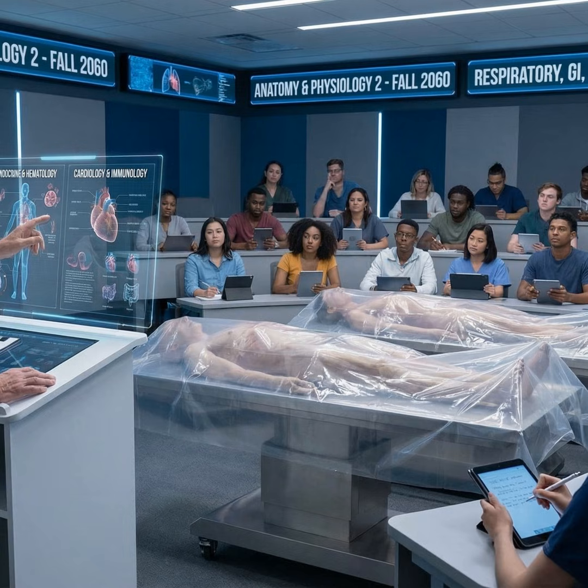Step 1, the very first number you should look for on any PFT report is the FEV1 to FVC ratio. Seriously, this is your starting point. It's the anchor for the entire diagnosis. This ratio is your first major clue. FEV1 is the volume you can force out in 1 second, and FVC is the total volume you can force out, right? Well, the relationship between them instantly puts you on one of two main paths. Either it's an obstructive disease or it's a restrictive disease. It's a fork in the road.